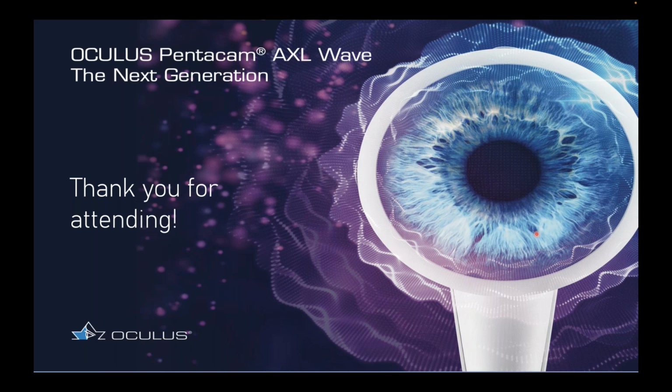Correct. You mentioned Ortho K, and it's been my experience also that your one-and-done rate has gone up since you've been using the actual data from the Pentacam versus a placido topographer. I know mine has. I thought I was a really good Ortho K fitter with a 70% one-and-done rate, and then switching to using the Pentacam data and designing lenses, I'm now at about 96% one-and-done, and it was shocking. I didn't really expect to get that much better.